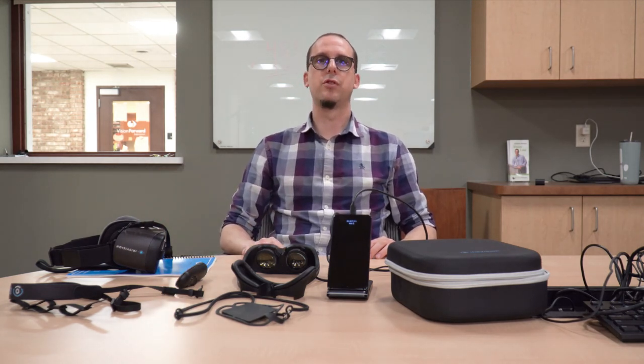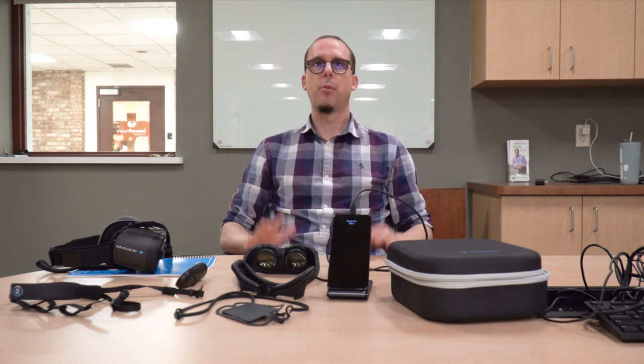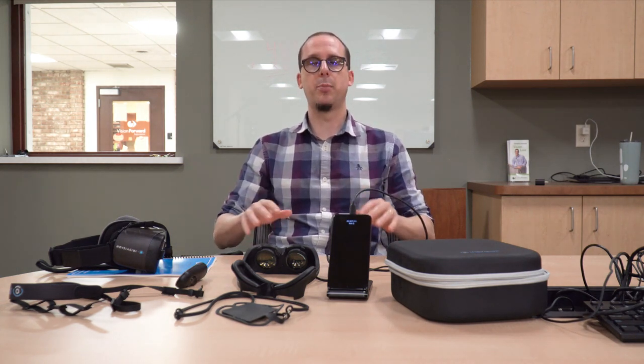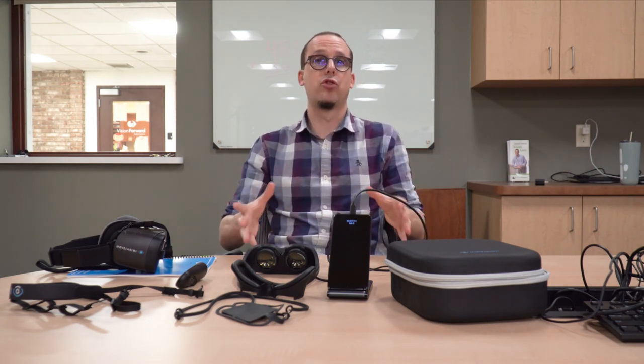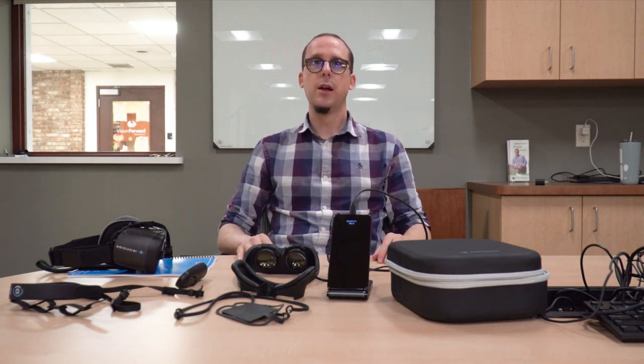IrisVision Live is $2,995 and IrisVision Inspire is $3,995 as of December 2021 - a significant price difference. I think Inspire is probably more the future of wearables and there's a lot of potential here. But it's quite a new product, and with new products there's always the possibility they're not fully featured when they first come out, which can be a risk. That said, Inspire really does reflect the future of wearables. Both IrisVision products are great - just make sure you get a demo to ensure it's right for you before purchasing.